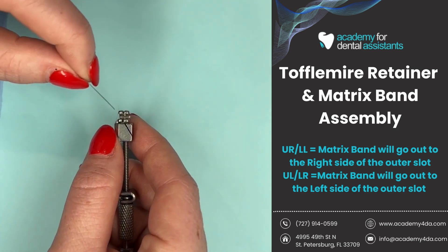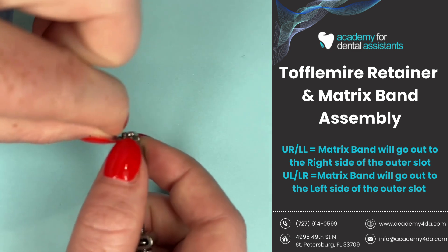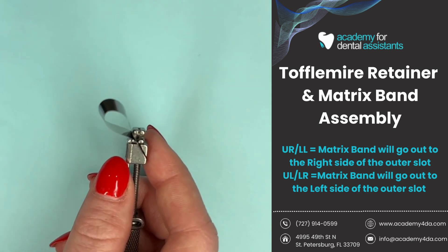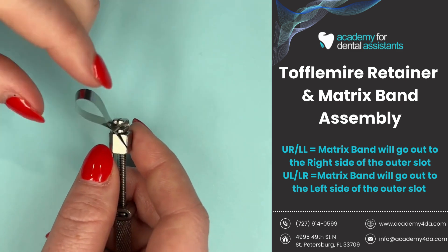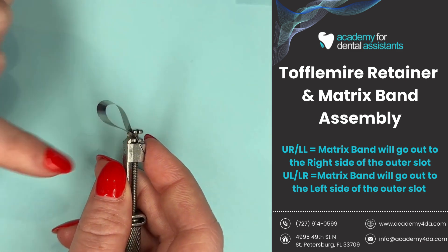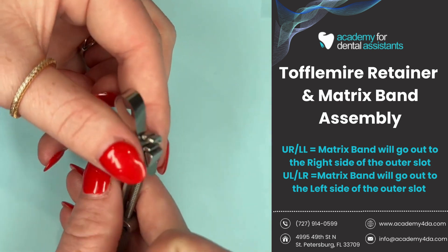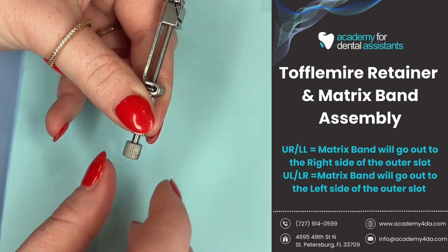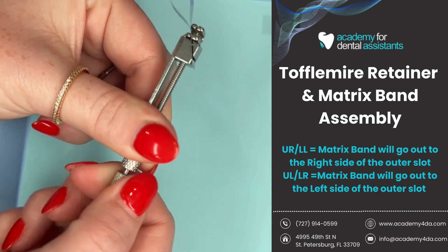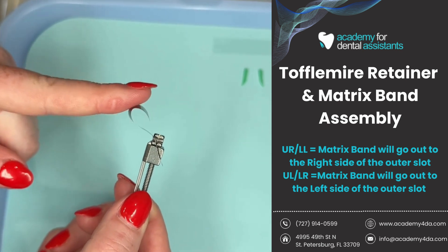Now that I have the tail ends pinched, I'm going to stick the tail ends of this matrix band through the diagonal slot on my Toffelmyer retainer. Because I'm doing a number 13 DO, I'm working on the upper left, so I'll make sure my matrix band goes out to the left side of the U-shape. I want to leave a little tail end sticking out of the diagonal slot. Then I twist my outer knob — the smaller one — to the right, which moves the spindle up and locks the matrix band into place. I'll keep twisting, then pull on it a little to confirm it's nice and tight.